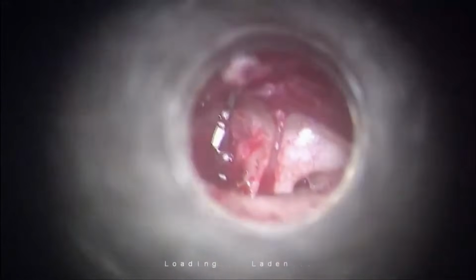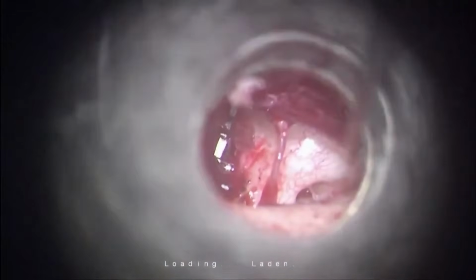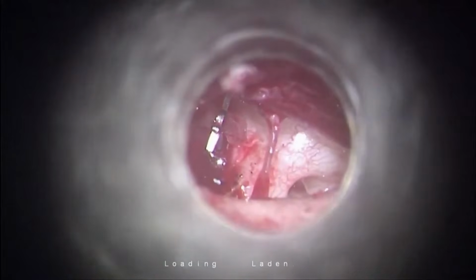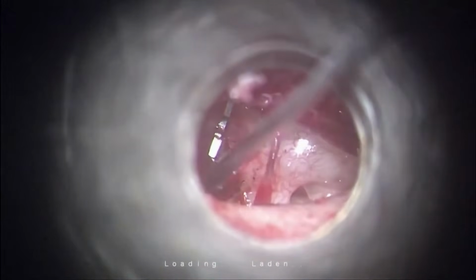And the last part now, we always use this direct piston technique. What I am going to use is a drop of blood over the fenestra to seal this. This blood contains fibrin, and this is an amazing material to seal the fenestra. Since the vestibule is full of perilymph, this blood is never going to go inside.